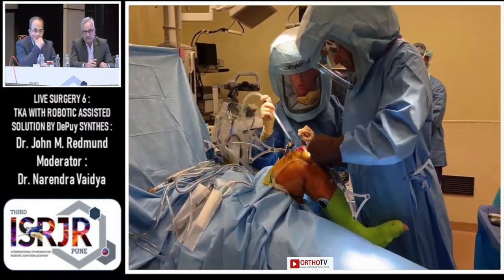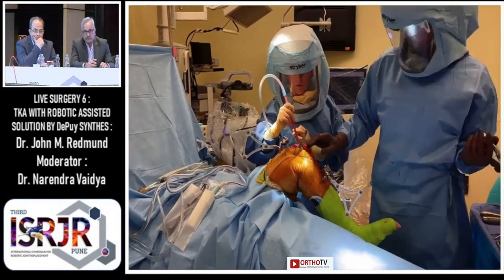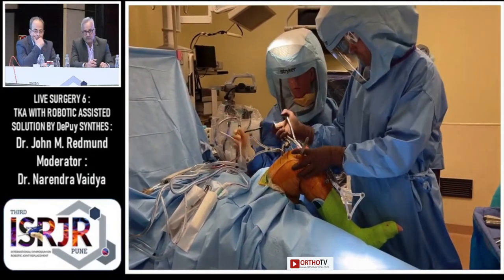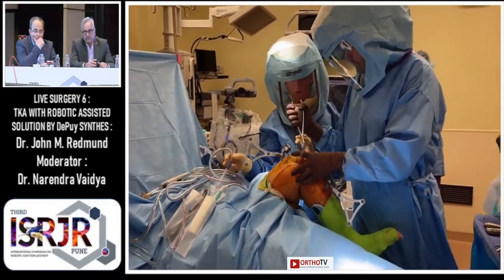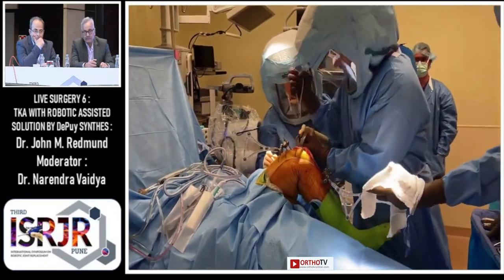Once I've verified the model, I'll collect soft tissue data. What I'm doing here is putting in some retractors so that I can remove all the osteophytes around the femur and the tibia.